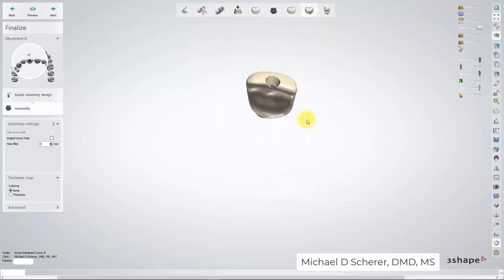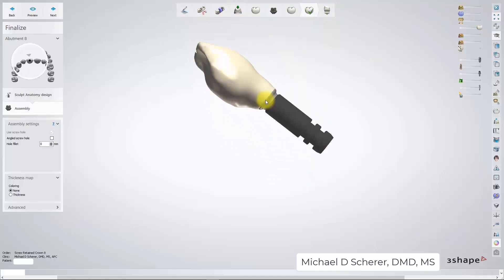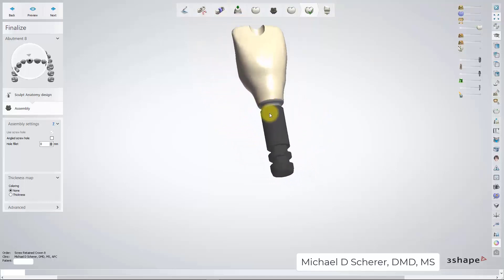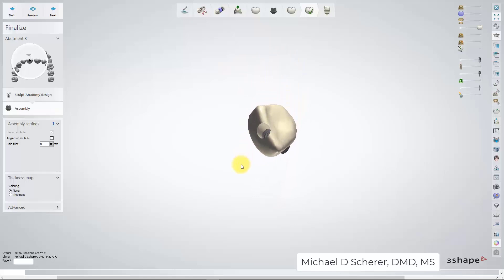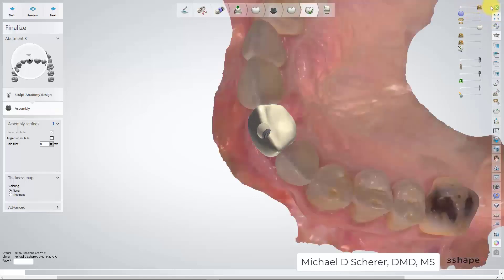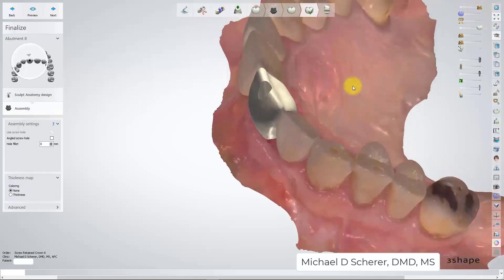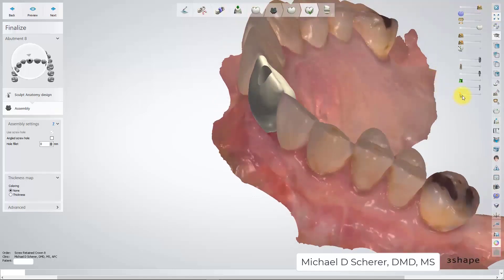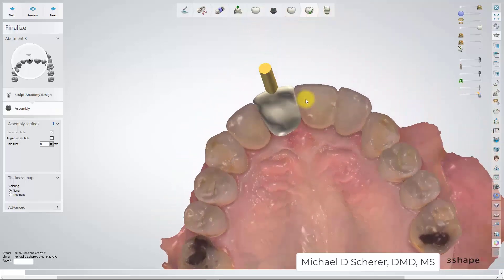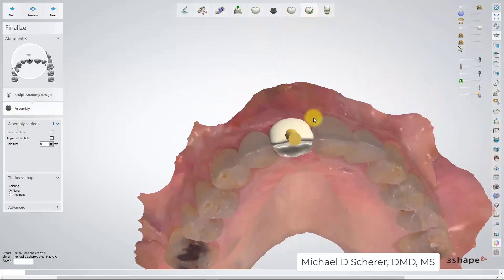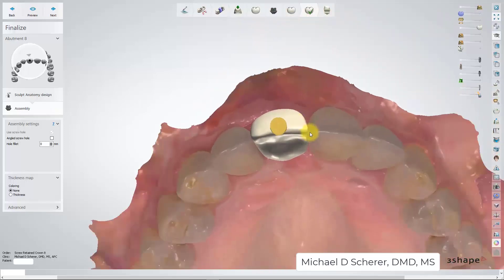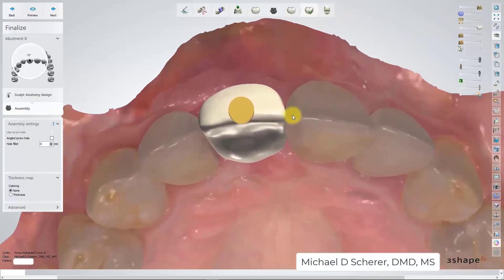Taking a look at what a traditional custom abutment or standard tie base would allow, this would make for a relatively un-aesthetic restoration. I could go ahead and just fill that with composite and still make a screw-retained crown, or simply just make a cement-retained crown.